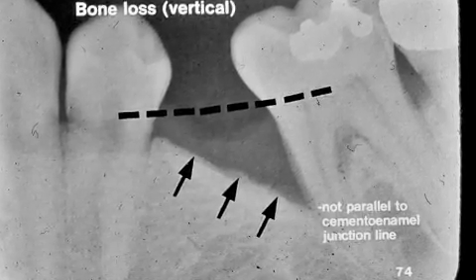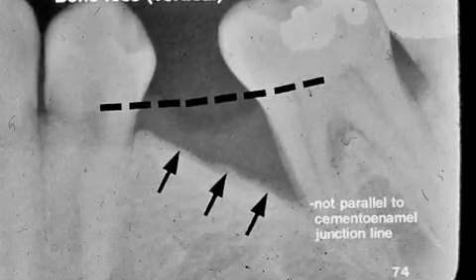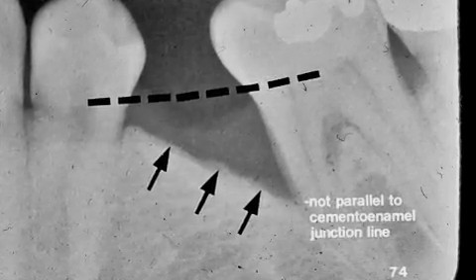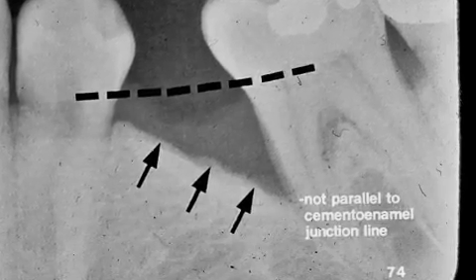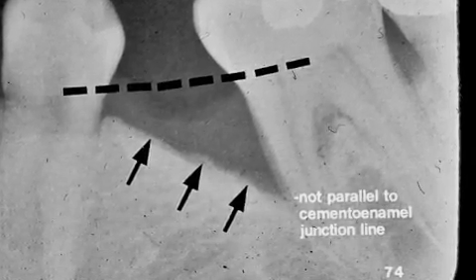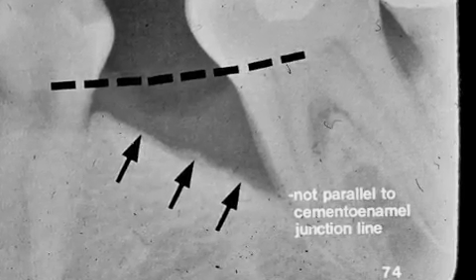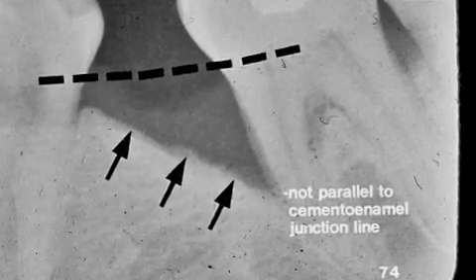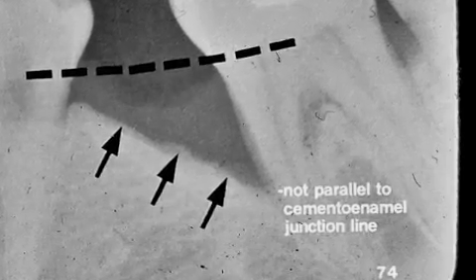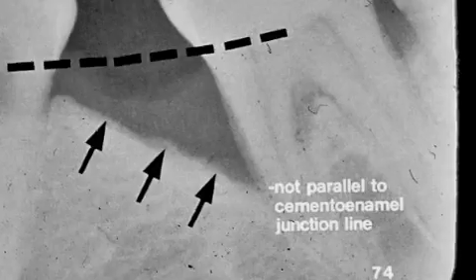The dotted line represents the benchmarked CEJ. Notice that the arrows point to the bone and it is not parallel with the benchmarked CEJ — it is at an angle. We call this vertical or angular bone loss.